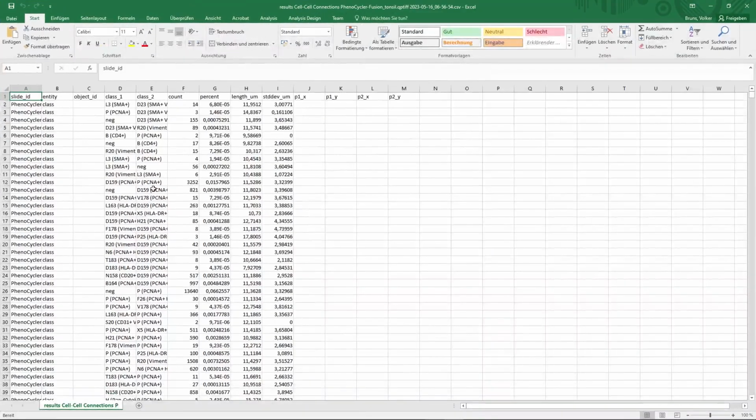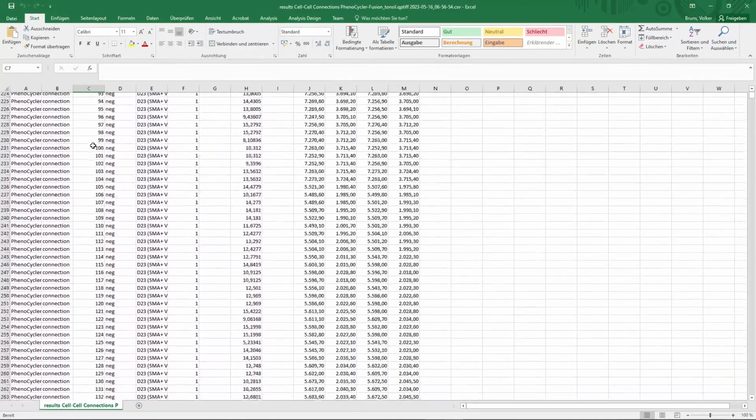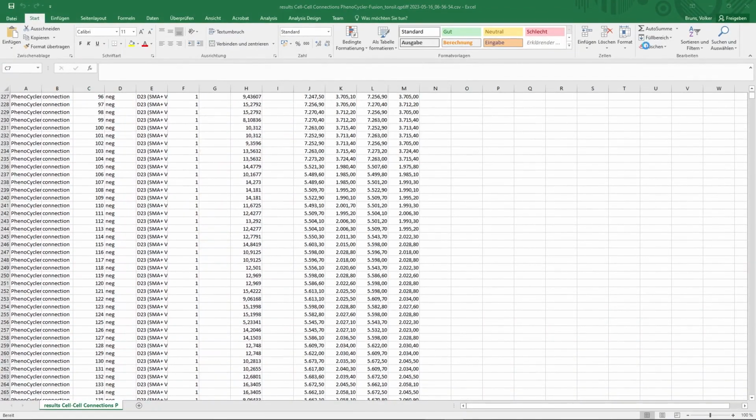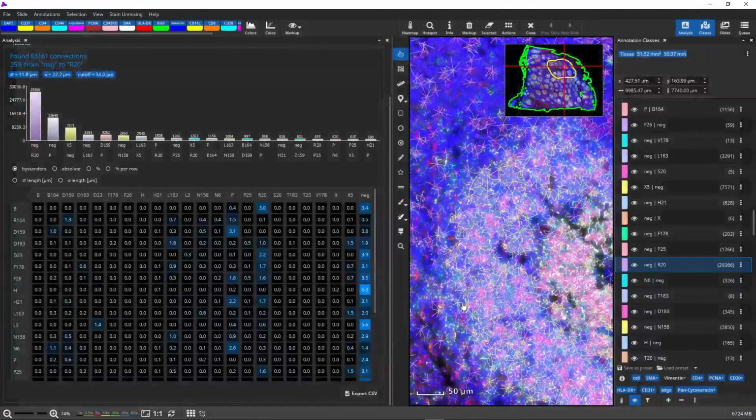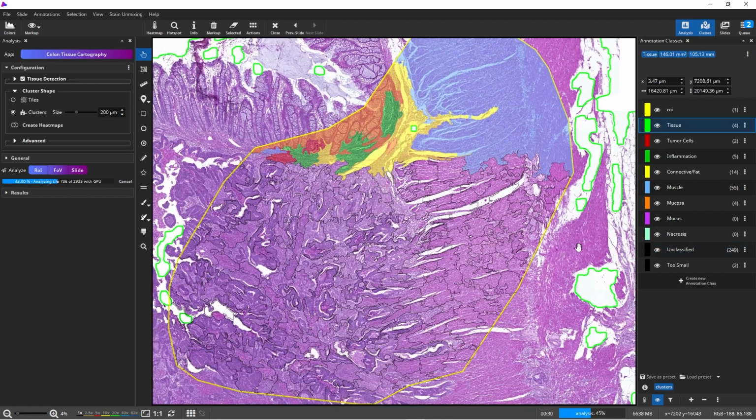It takes maybe an hour or two, but you don't have to sit and watch. And in the end, you really have a statistically significant basis to answer your research question. Another advantage is that if you work digitally, it'll probably be faster, because if you have to do it manually, it takes a lot of time to find hotspots in multiple slides, count cells, measure tissue areas.